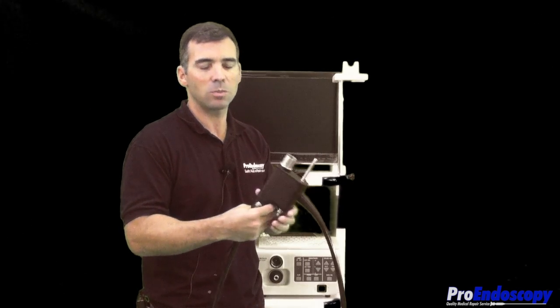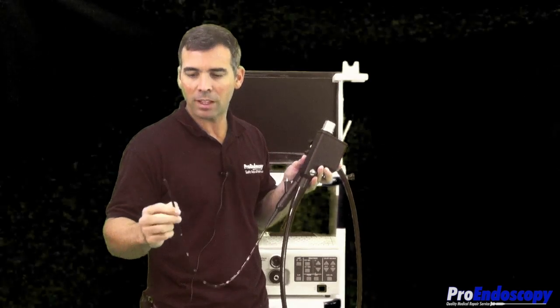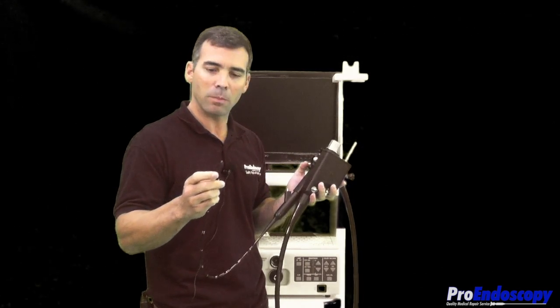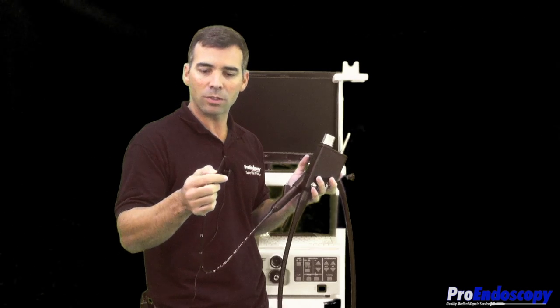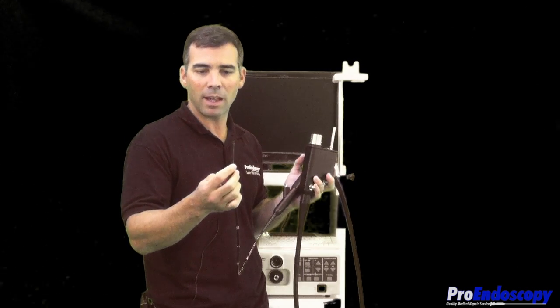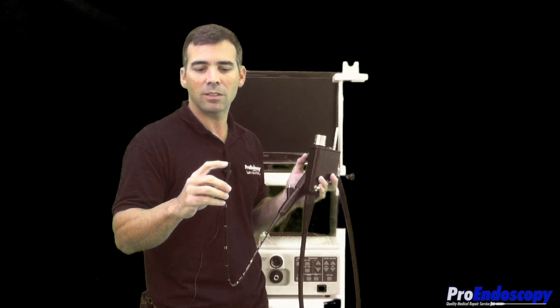This customer sent this scope to us for service and repair. Their angulation was damaged at the distal tip over here where the angulation is. Their bending rubber also had a tear in it, so we replaced that. But a lot of times that happens during procedure or their biopsy channel gets damaged as well.